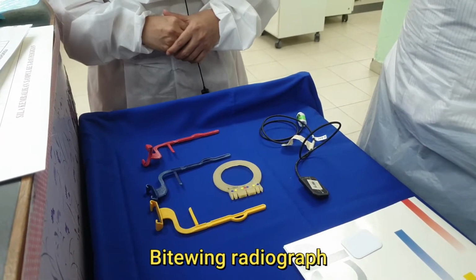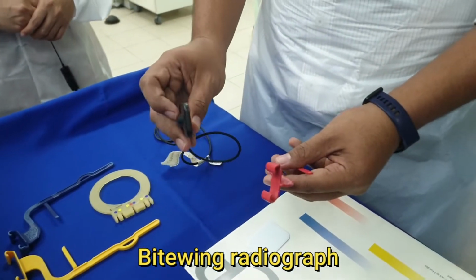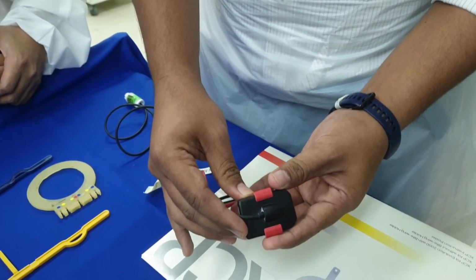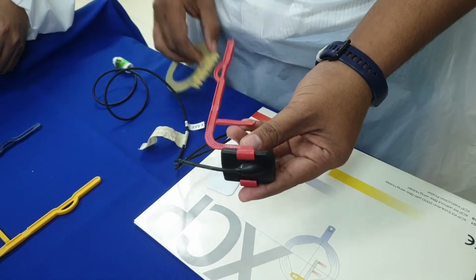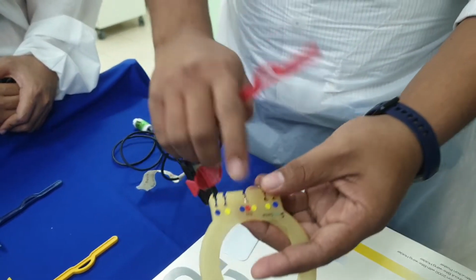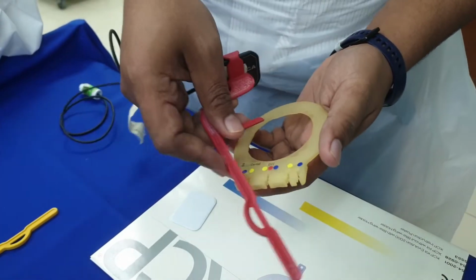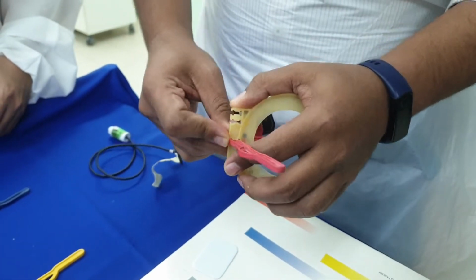the Bitewing radiograph. Get the holder, put the sensor in the holder. Okay, make sure the wire is opposite the tube. Alright. Check the locator ring for Bitewing. Place the holder.